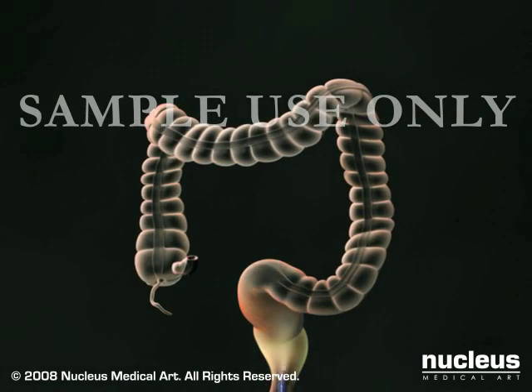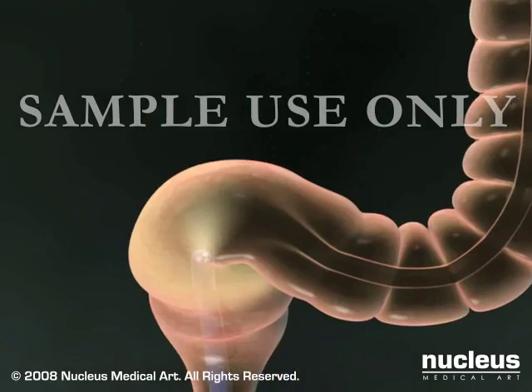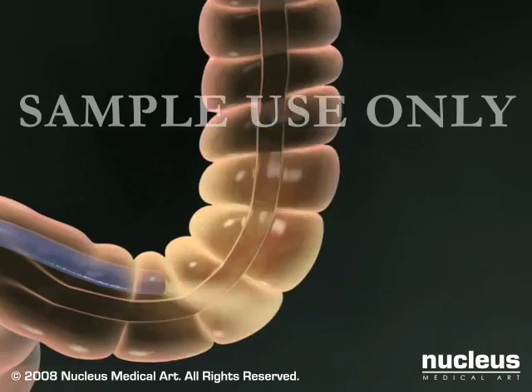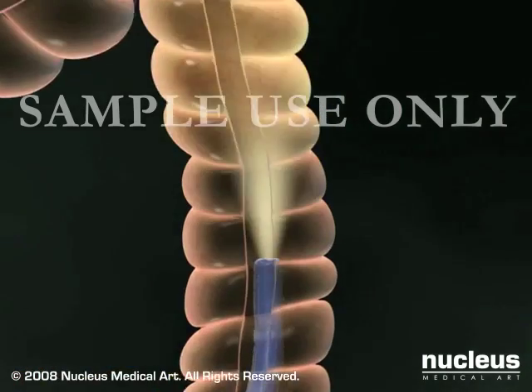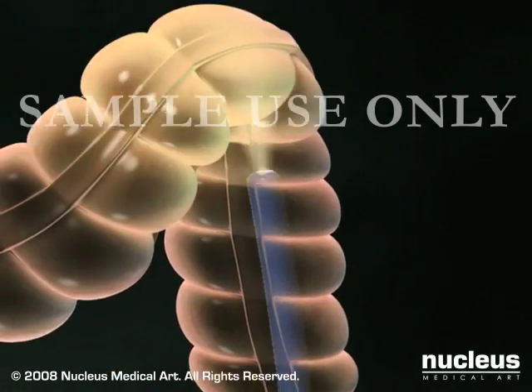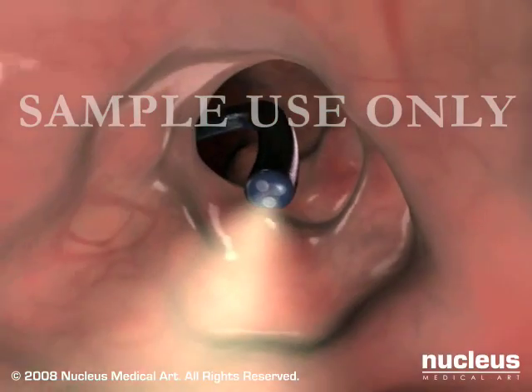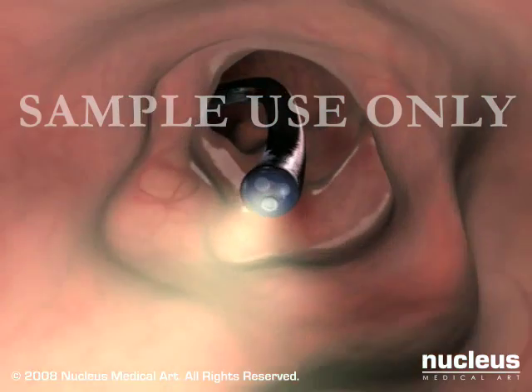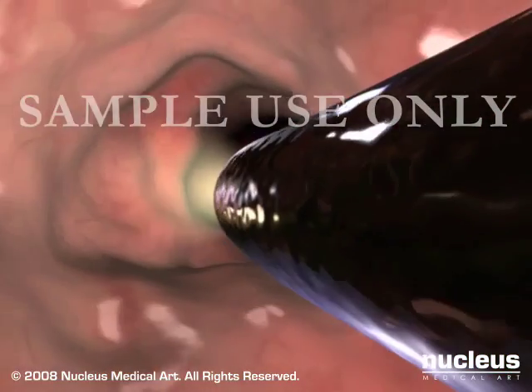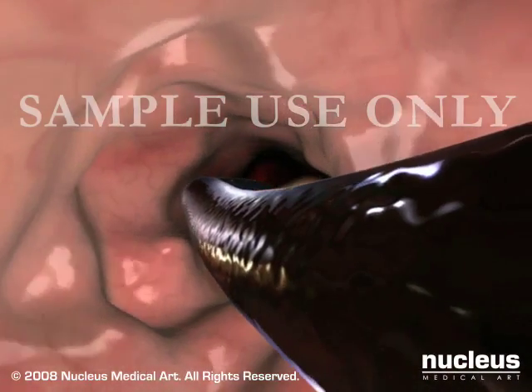The presence of the endoscope and the air may cause you to feel cramping or pressure and the need to pass gas. This is considered a normal part of the procedure. Your doctor may ask you to change your position slightly to help maneuver the endoscope more easily through the curves of your lower intestine. If you experience pain, tell your doctor immediately.